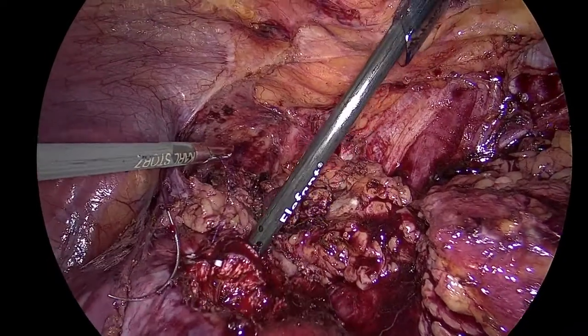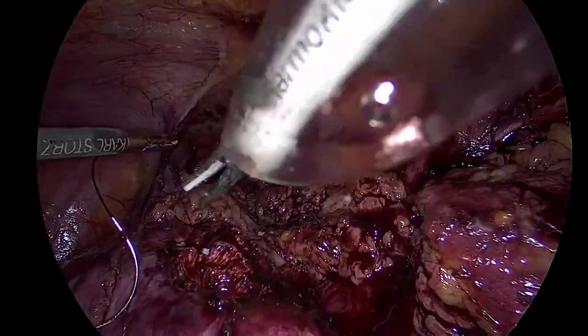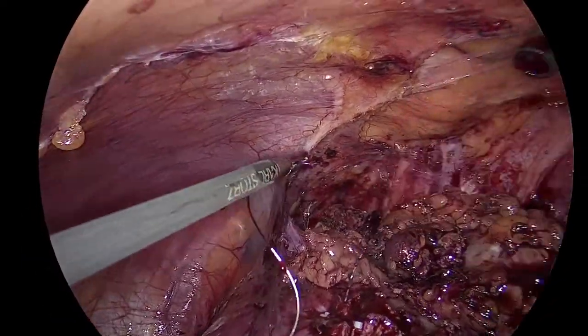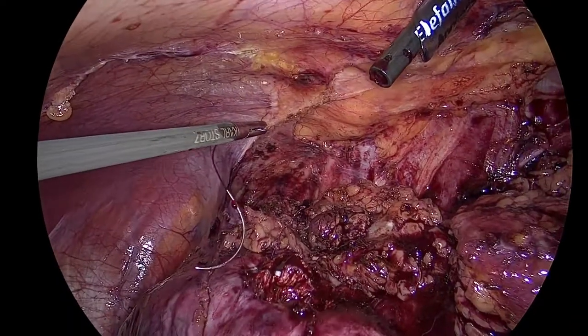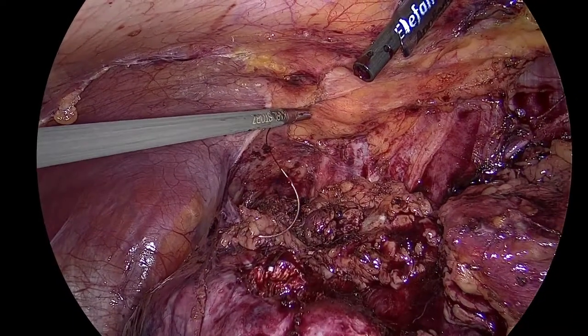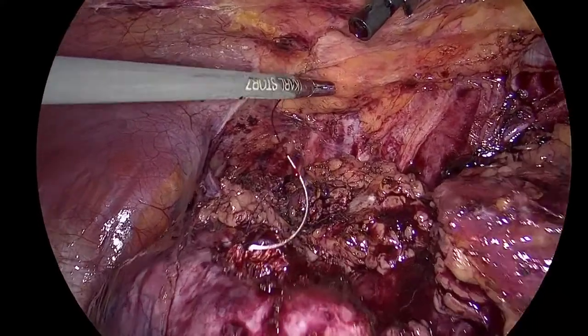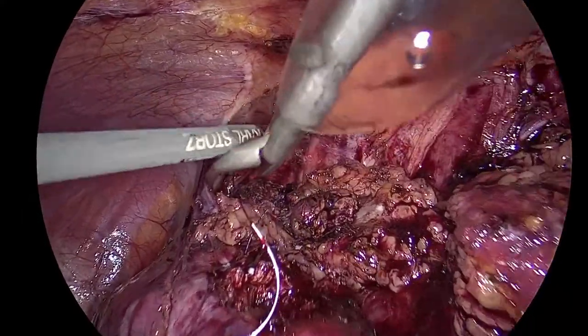Fine, don't aspirate anymore. So now we have no stress because we have dealt with the bleeding, we have no clamping, and we can evaluate. Give me the other suture now, the Vicryl. Needle holder, take the needle out. Any questions, please feel free to ask.